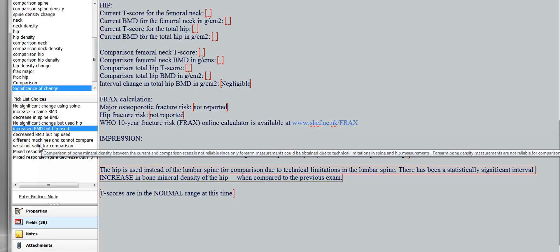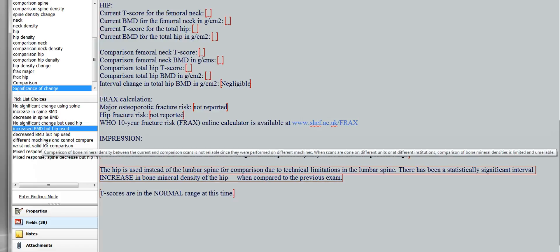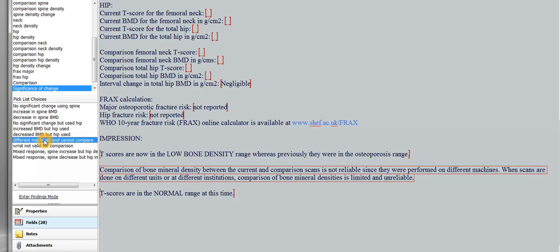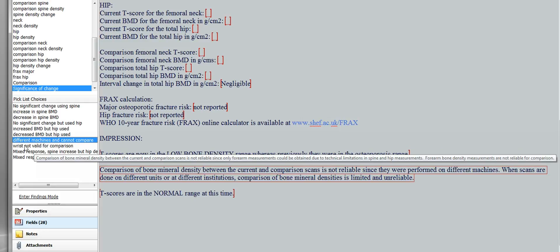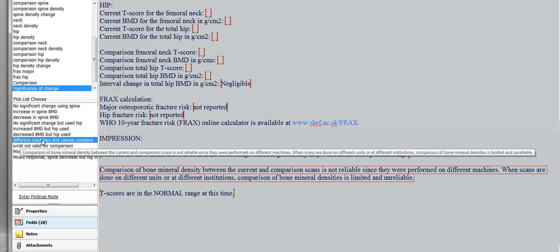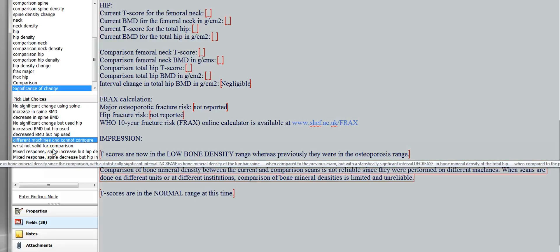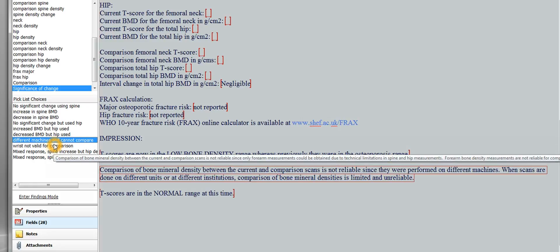And then, now very often, the comparisons are going to be on different machines. So you're going to click this one here that says different machines, and you would say comparison of bone mineral density between the current and comparison scans is not reliable, since they were performed on different machines. When scans are done on different units or at different institutions, comparison of bone mineral densities is limited and unreliable.